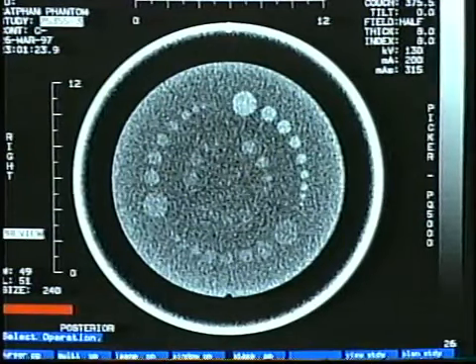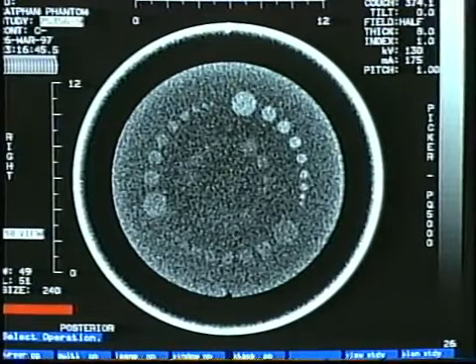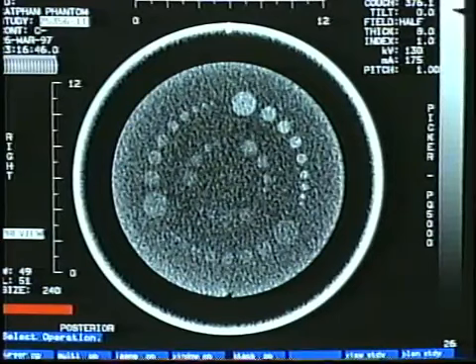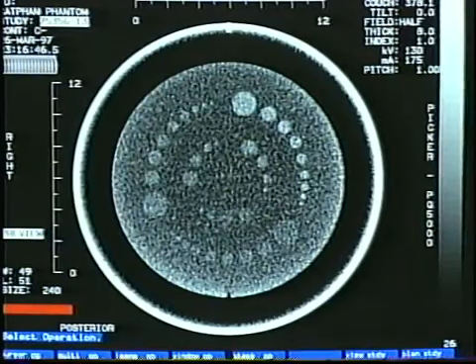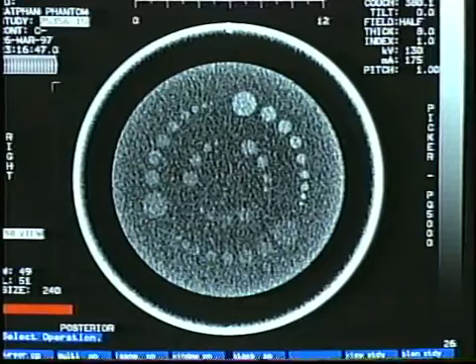In this spiral scan sequence, with 8 millimeter slices and an index of 1 millimeter, the subslice objects in the center intensify and disappear as the table moves the phantom. To test subslice low-contrast details, this test module includes truncated cylinders with 3, 5, and 7 millimeter lengths. These are cast from the same pouring of the material used in the 1% supraslice test object.